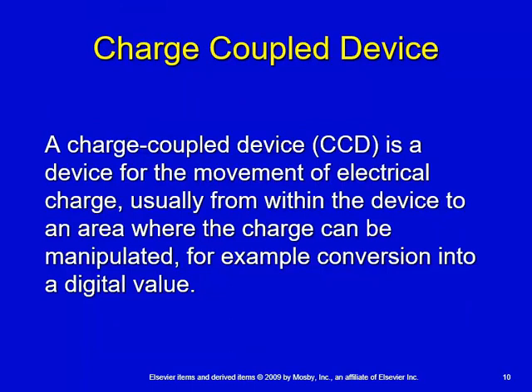A charge-coupled device is a device that's used to manipulate and move electric charges so that you can manipulate them and digitize them, so that you can use an analog signal and create a digital signal out of it.